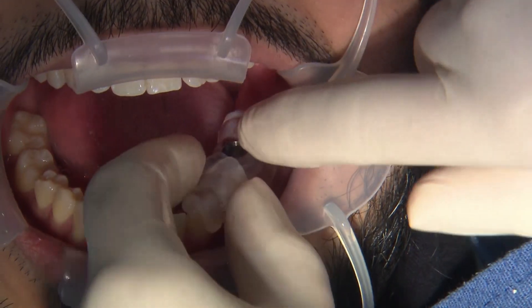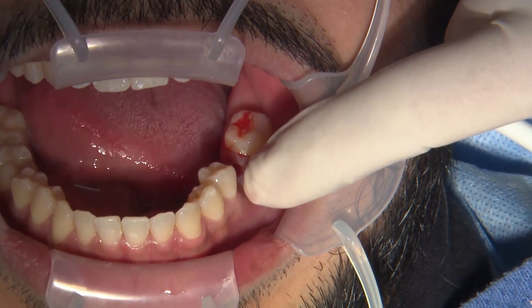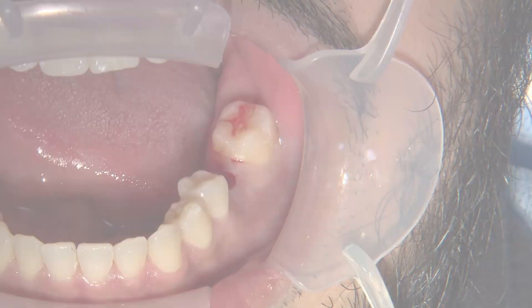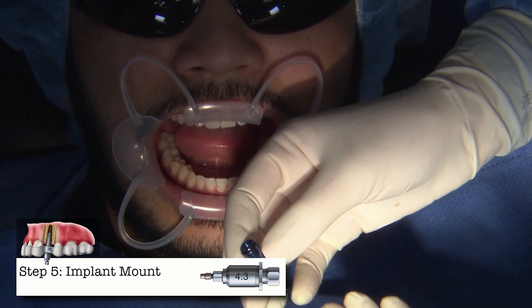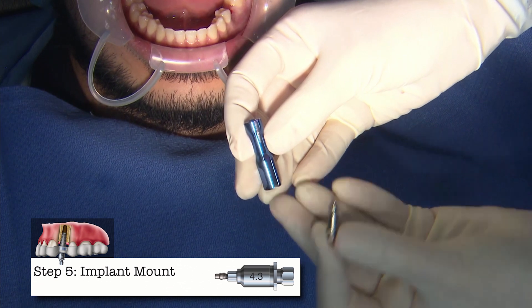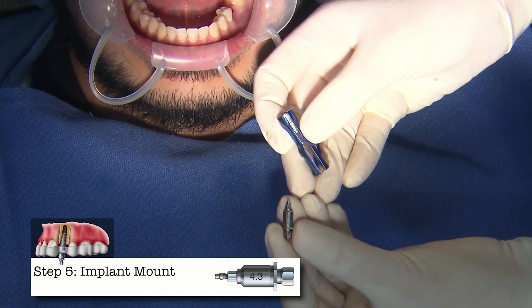Now we are ready to place our implant. I do like to just rinse out the site really well. This is our Han implant — this is how it comes packaged. This is our final step with the kit; this is our implant mount.